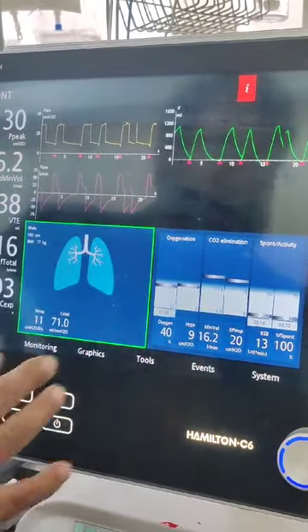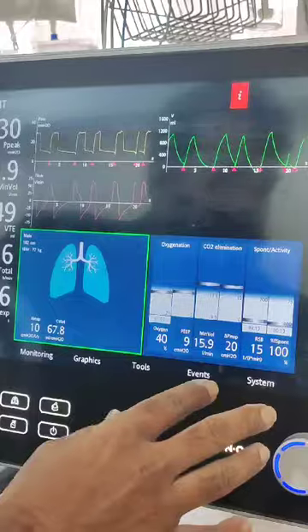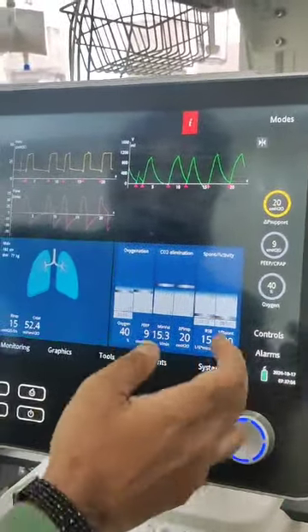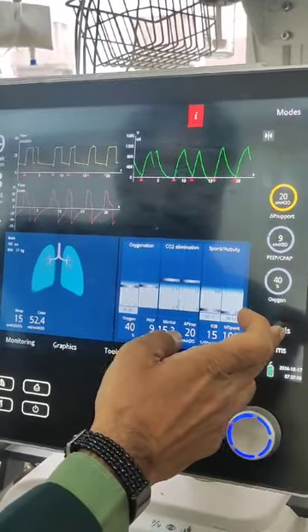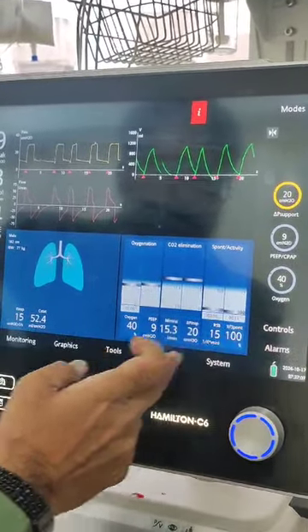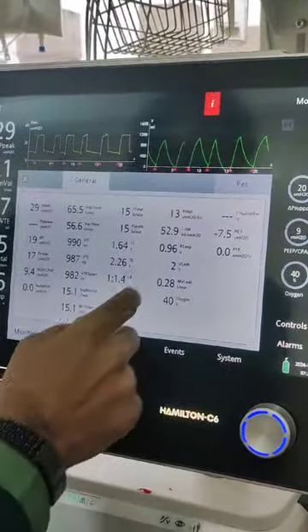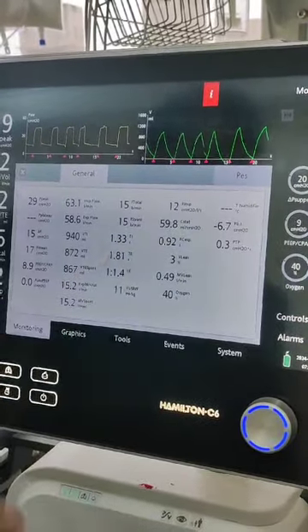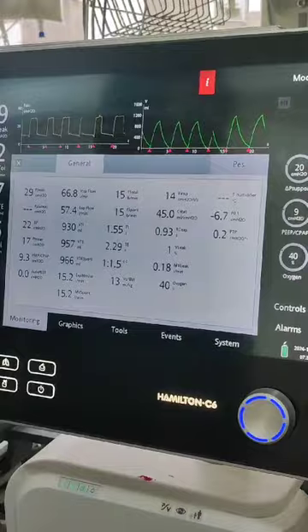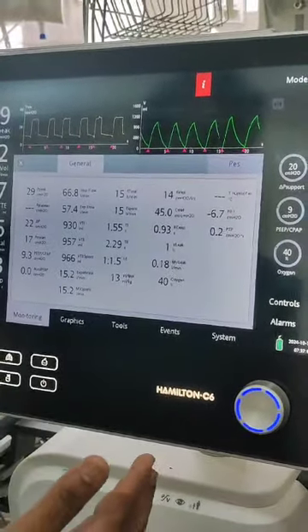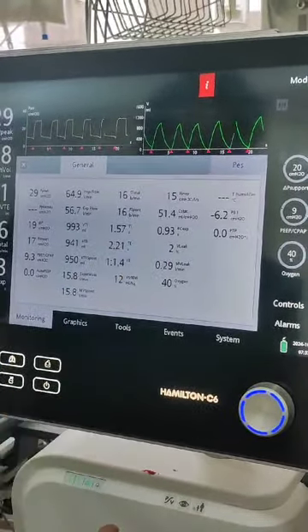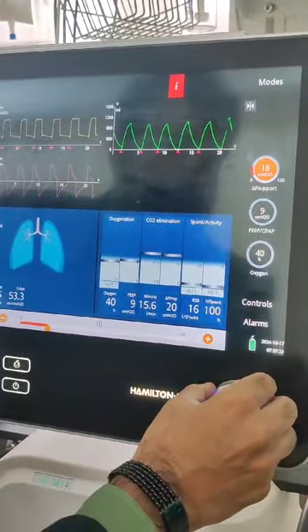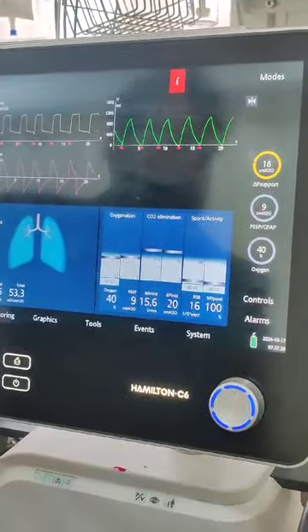What we should also see is the P0.1 coming back to normal. Let me go to the monitoring tools and check. The P0.1 has already come down to minus 7.5, minus 6.7 — nearing normal values. It was initially minus 22. So it's now at 6.2. Let me see whether this is over-resistance. I'm going to come down to 18.